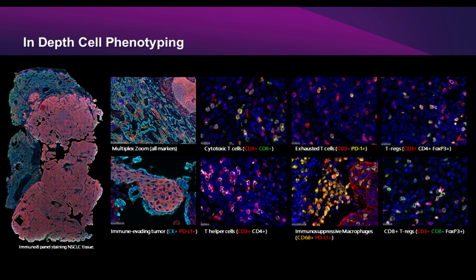Thank you both. Can this multiplex IF be applied on cytochemistry? I have a lot of experience doing multiplex IF on cytochemistry preps, and I haven't actually tried Ultivue technology on it, so I would be curious what Katir would say. But in my experience with multiplex IF on cytochemistry, it's highly dependent on how the samples, or cells rather, are fixed and prepped.